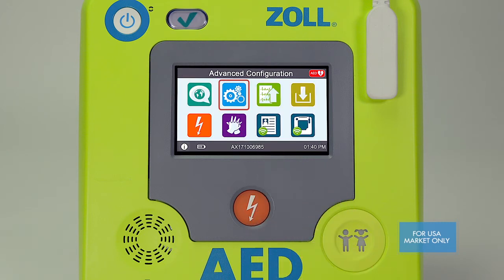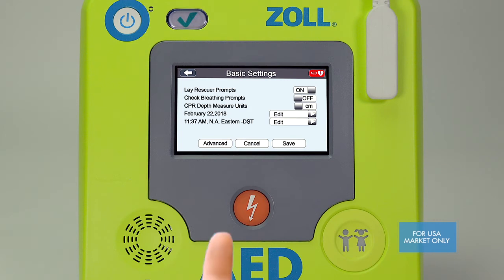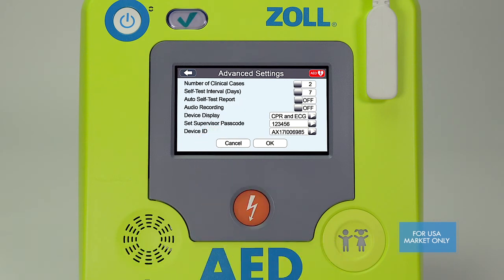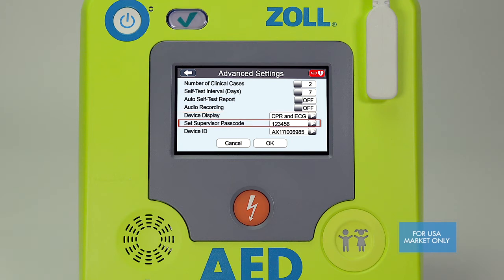The blue gear icon is similar to the item that appeared on the previous basic configuration screen. However, when you open this setting screen, you'll notice there are advanced configuration settings accessible at the bottom left. In this screen you can select: 1) the number of clinical case files you want the AED to store, 2) how frequently you would like automatic self-tests done, 3) whether you want to transmit self-test reports to your program management platform over Wi-Fi, 4) how you would like to display feedback data on the screen, 5) if you'd like to change your password, and 6) how you want the AED to be identified in case review. Make your desired changes and select Save.